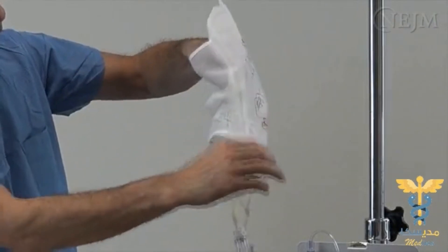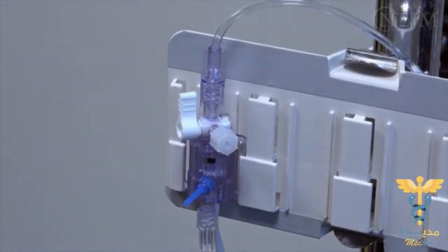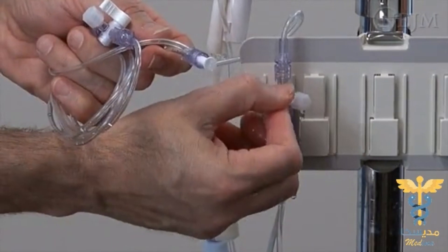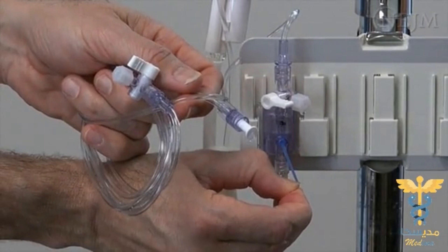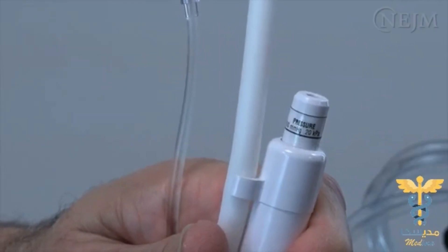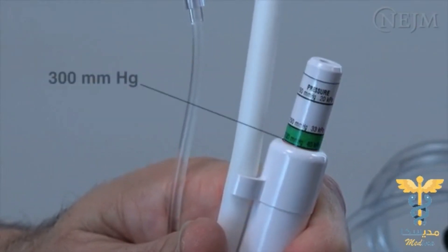Place the fluid bag inside a pressure infuser and hang it from an IV pole. Turn the stopcock 90 degrees toward the patient's end of the tubing to open the vent port, and allow fluid to run through until all the air bubbles have been purged. Close the vent port and open the flush valve by pulling on the pigtail until the remaining tubing is filled with fluid. The pressure infuser should now be inflated to approximately 300 mmHg, ensuring a slow continuous flow of approximately 3 cc per hour and preventing backflow of blood into the transducer system.